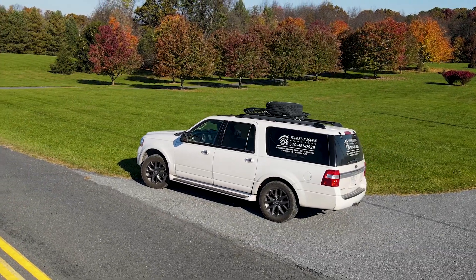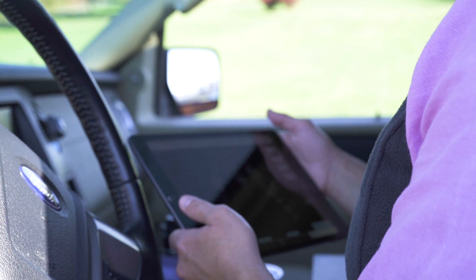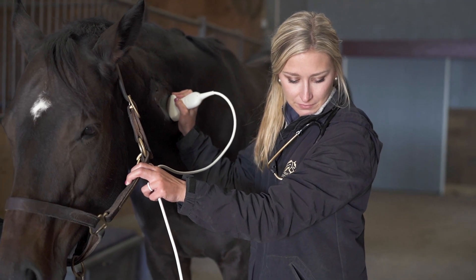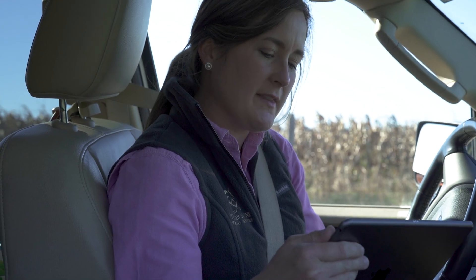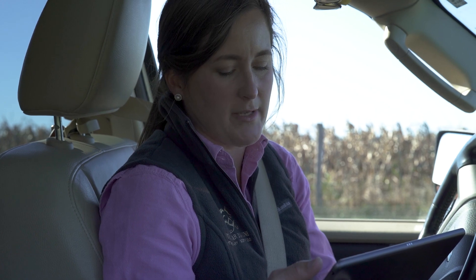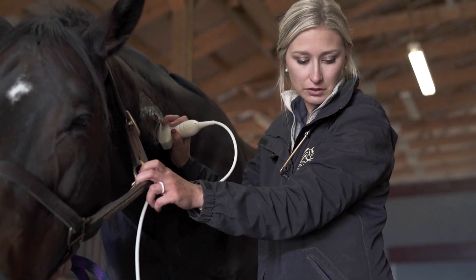Alright Katie, I'm logged in. I can see what you're seeing now. I see her on C4-5. Just let me know when you get there. I'm there. Can you rotate the probe a little bit? I need to see the cranial facet of C5 a little better. Do you see that part right there? That's kind of what I thought looked abnormal.